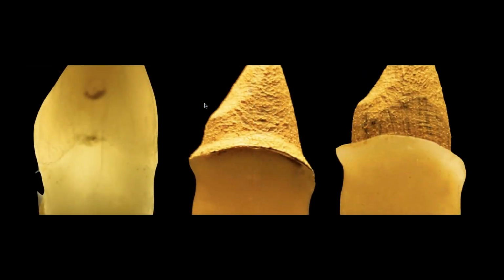What really is the most important for me in full coverage, if I'm going to be doing full coverage, which I still do, either metal ceramic, zirconia, or lithium disilicate, is still to get light transmission into the tooth. And I usually do that by reducing the actual subframe to allow more light into the tooth, and using ceramic margin material. That's a standard for me in metal ceramics and zirconia. I don't do it as much in lithium disilicate today, but the other two, 100%.